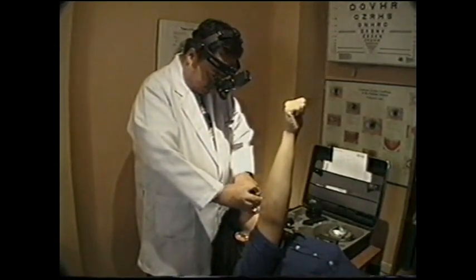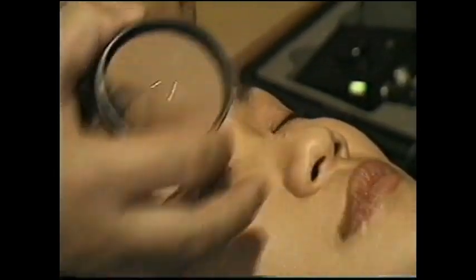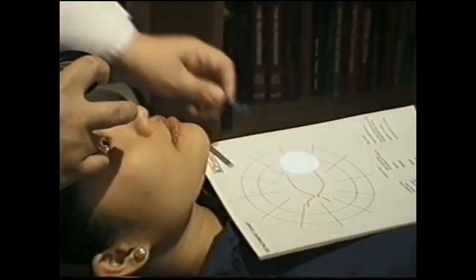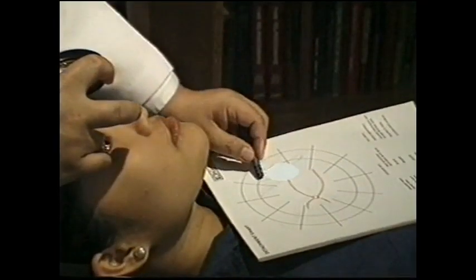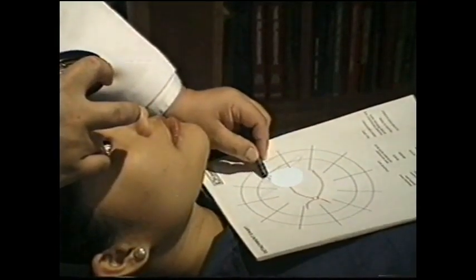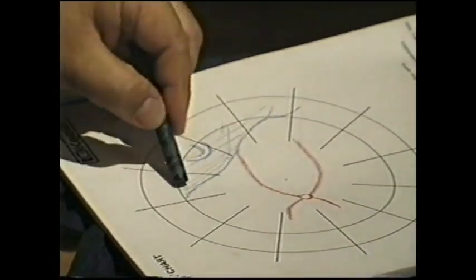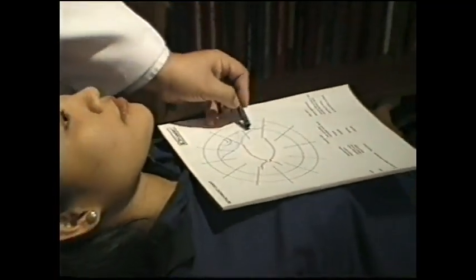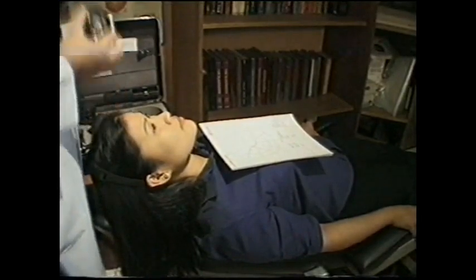Hold the condensing lens in the standard manner, position it just in front of the patient's eye, and center the pupil in it. Focus the lens by moving it upward and downward until you see a stereoscopic focused image of the fundus. Accommodate on this image with both eyes and maintain it by keeping the headset's light in the patient's eye. Examine all areas of the fundus, doing scleral depression if necessary to examine the far periphery of the retina. Make the fundus drawing as you go along in your examination.